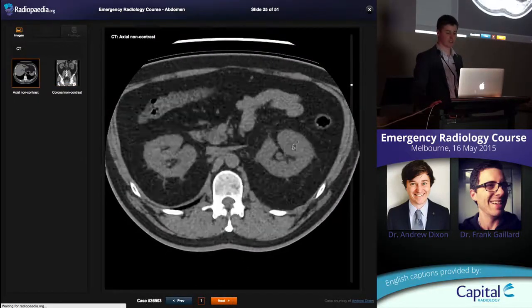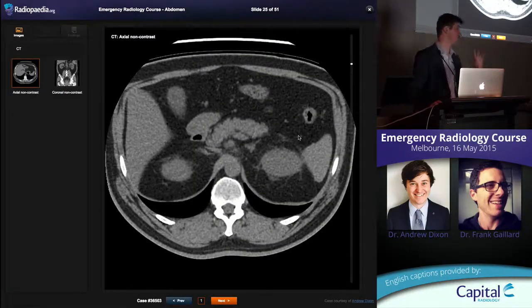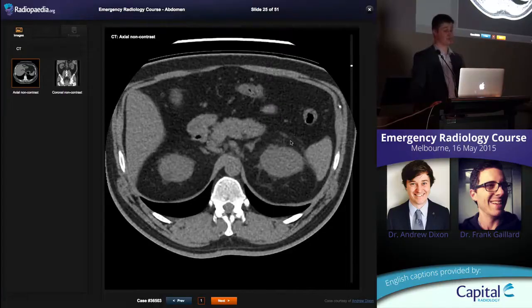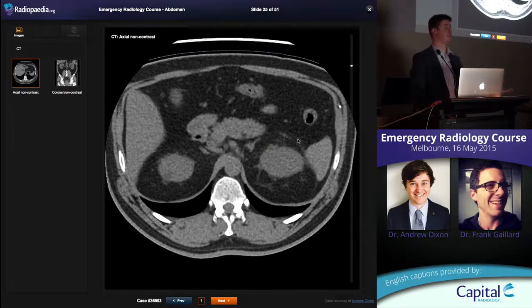Okay, here's another patient. You should be able to tell from the first few slices. I can tell if a patient's got a ureteric stone from the top of the scan like that. You say, which side is it on? They've got left pain, haven't they?